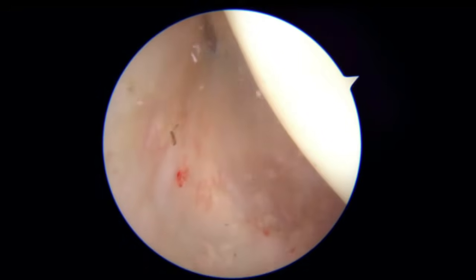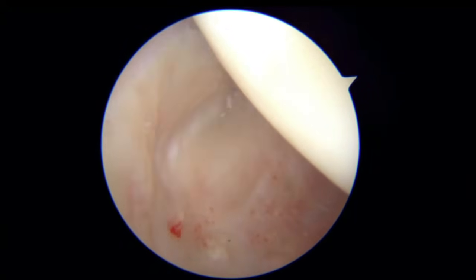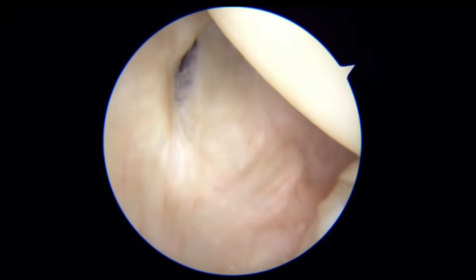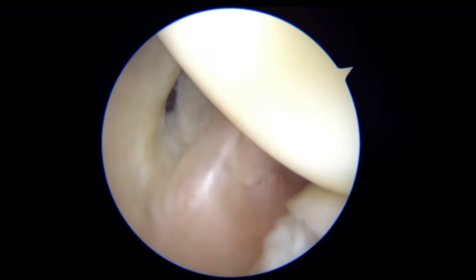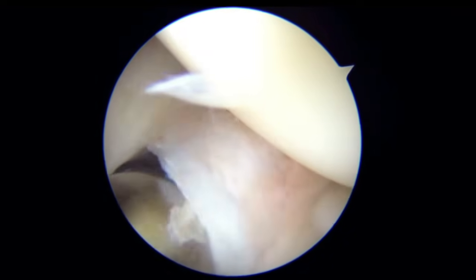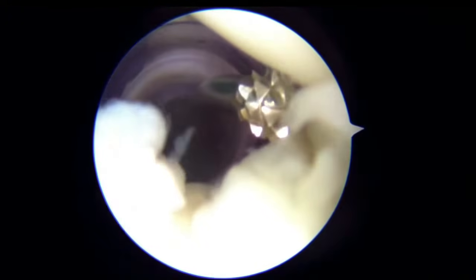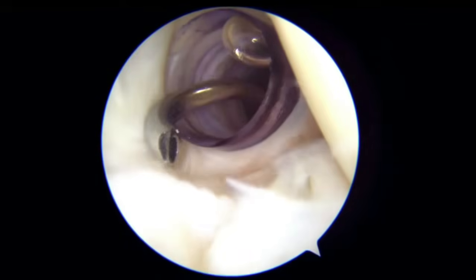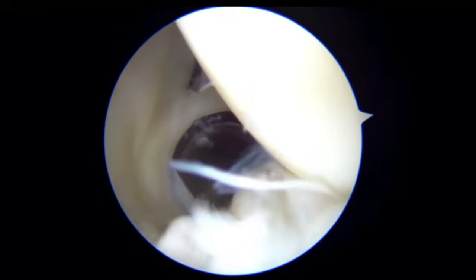And coming to the repair, you first put the portals. Here we have to establish two portals, posteromedial superior and posteromedial inferior portals. So you put the needle, the number 11 blade, then put the Wissinger rod inside and dilate it, and then put in the plastic cannulas. And with the rasp, you make the edges fresh. And after that, you put in the lasso to take the bites.